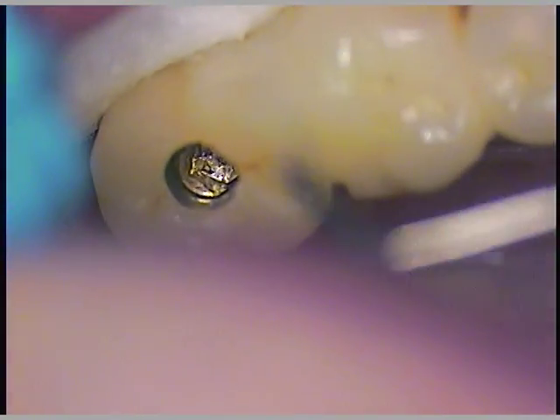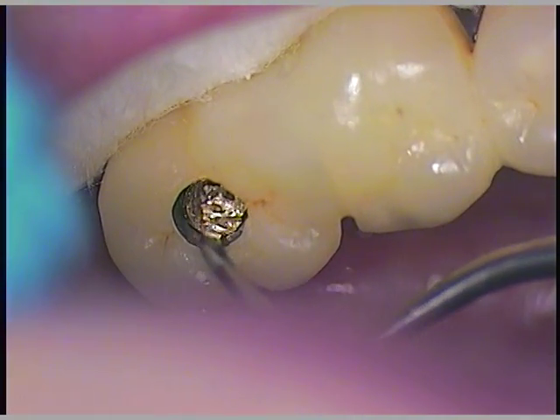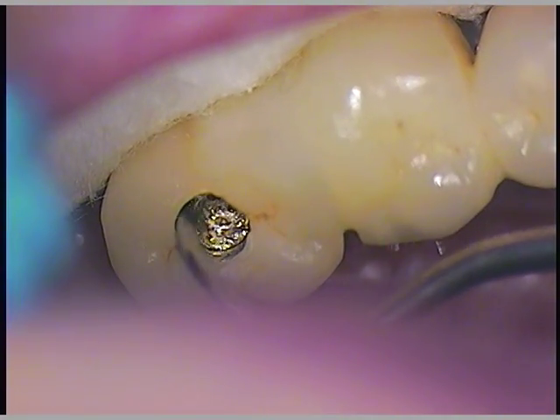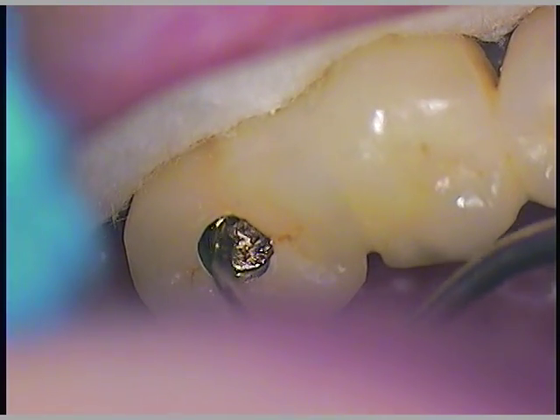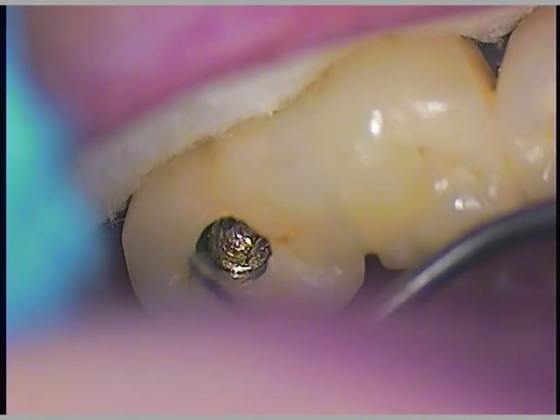We're picking this up again live. I'm going to go ahead and back in here. We did manage to get some movement to the screw after pre-soaking. The key is to make sure you join this to the adjacent tooth. It has some nice natural little grooves I could grab onto.